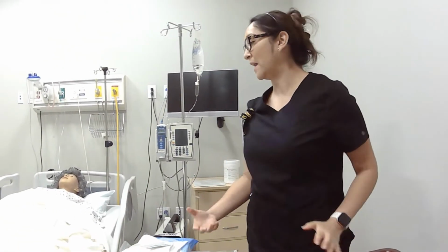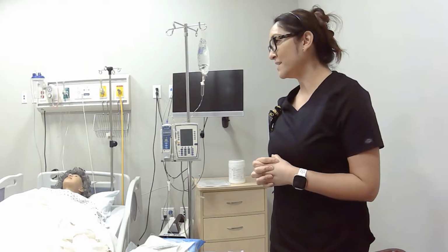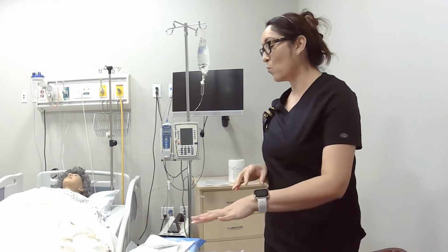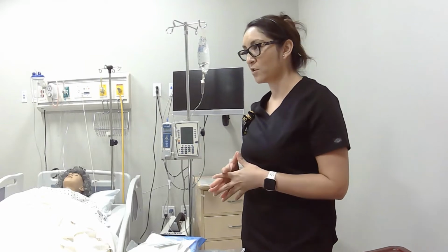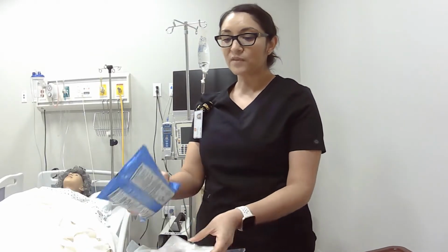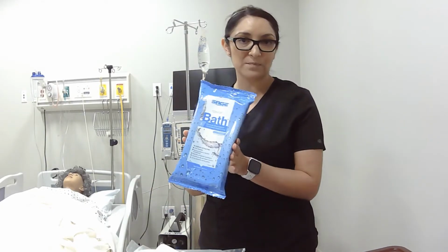So, first off, Ms. Adams, we are going to do what's called peri-care. So I am going to clean your perineal area with some wipes. So it's just like soap and water wipes. But make sure that depending on your facility, you use whatever is appropriate. Some facilities might use CHG wipes, which is chlorhexidine gluconate. Others may just have regular comfort wipes or bath wipes.